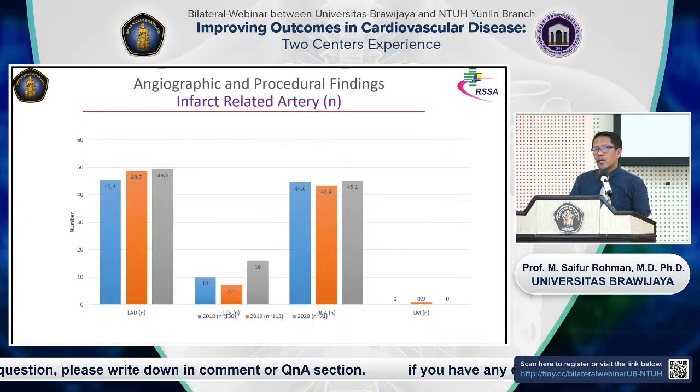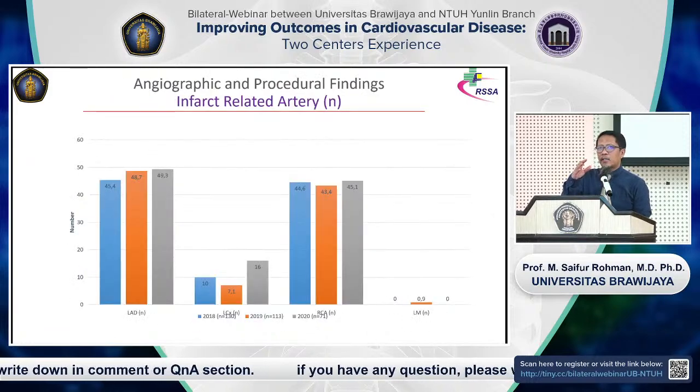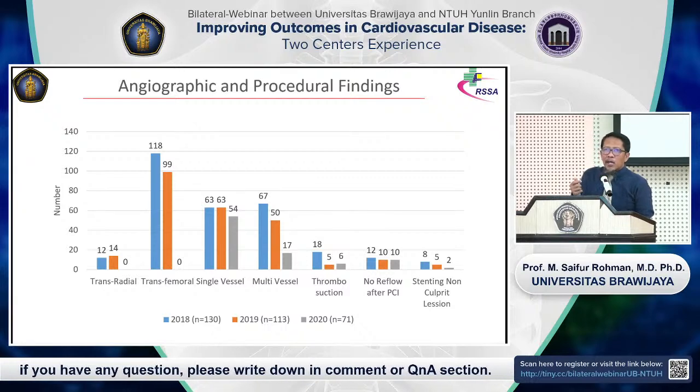As we can see here, we mostly perform femoral access, and we focus on the culprit lesion instead of complete revascularization.